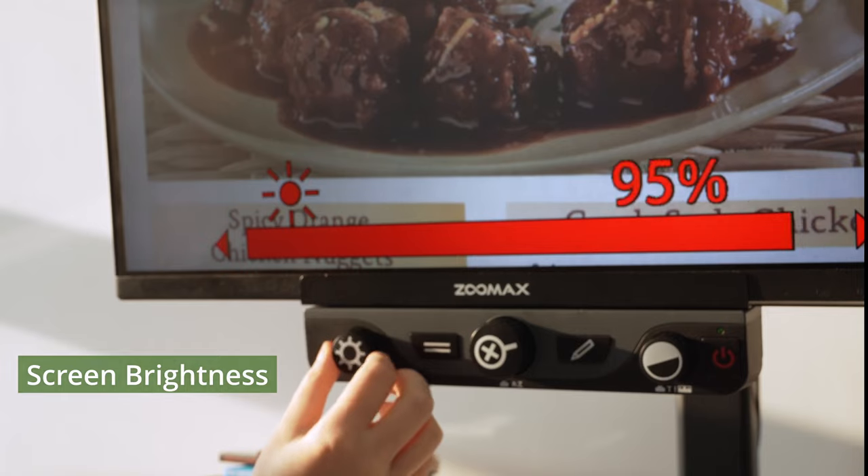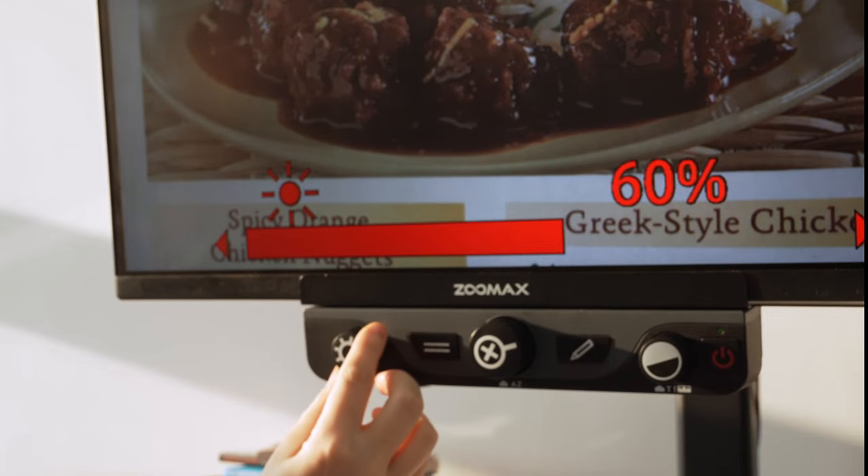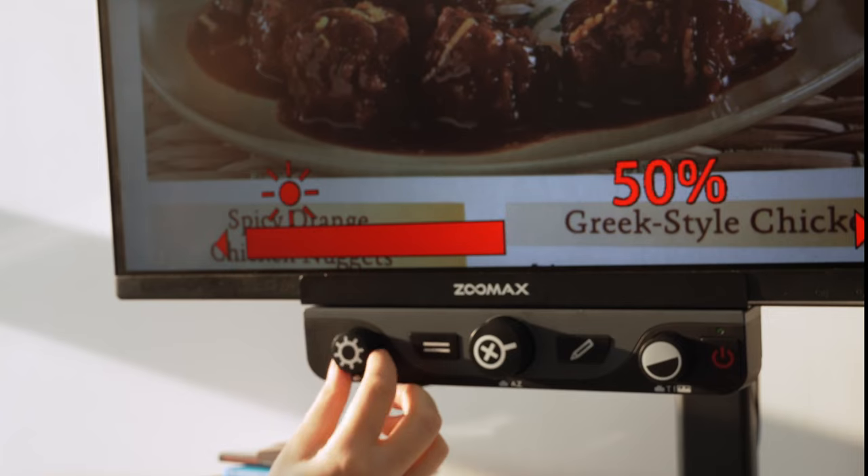Screen Brightness Dial: by turning the brightness dial, you can adjust the screen brightness for a better reading experience.